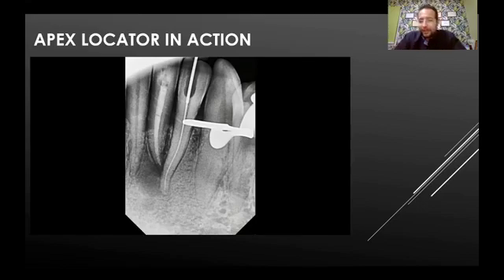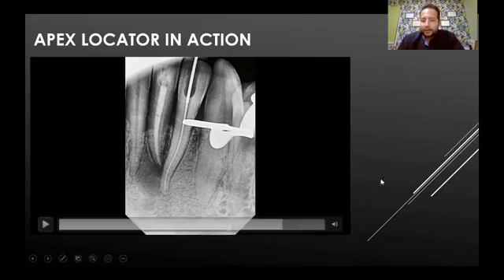It will take a lot of effort, but don't listen to me. Take a working length X-ray, because it's not just to confirm your working length, but also to give you a lot of information about the canal's relation with each other, the canal curvature, as we said in this. It will give you really good information. Don't be lazy, please. So let's see another.